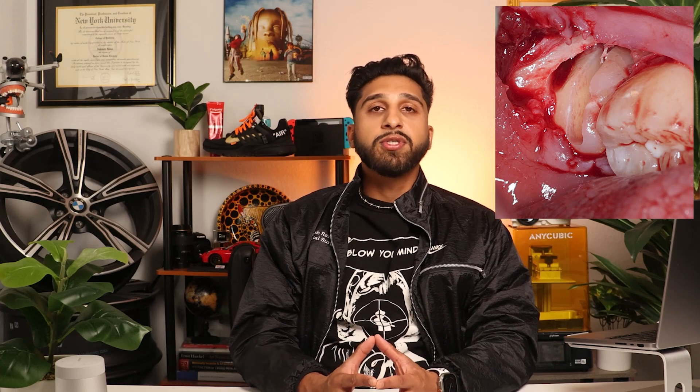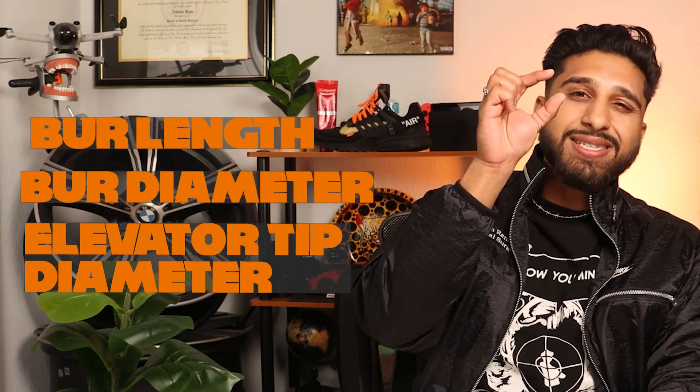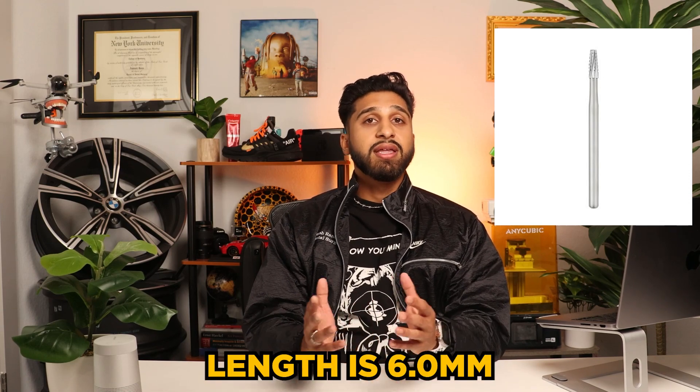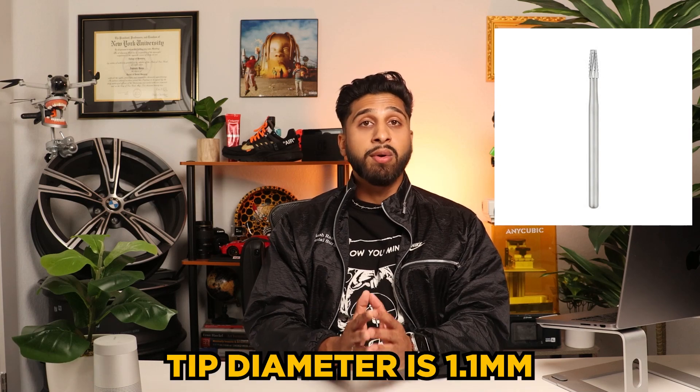Now we've got to give a nice slice to that tooth so we can get it out of there. Sectioning the coronal portion of the tooth is needed in this case to create space for the roots and crown to come out separately. While sectioning, it's important to consider burr length, burr diameter, and elevator tip diameter. You want to remove the least amount of bone possible, but enough to place an instrument in there to leverage the tooth out. The burr I'm using here is the 702 burr — the classic oral surgery burr. The working length is 6mm, the head diameter is 1.6mm, and the tip diameter is 1.1mm.